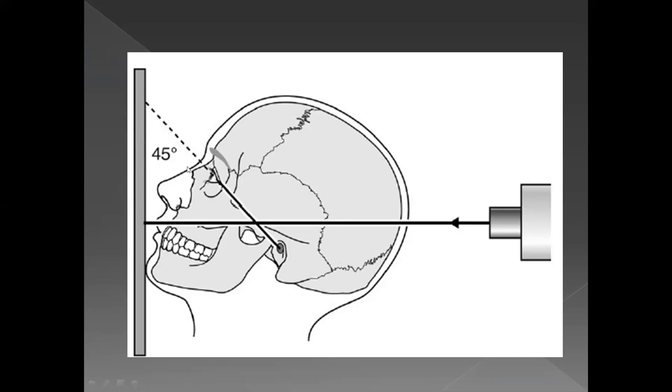And the standard line that we use is this canto-meatal line. In some places, you can also see it mentioned as OML, which is orbitomeatal line. So you can also call it that, the orbitomeatal line. So this orbitomeatal line has to make a 45-degree angle with the X-ray film. This is the X-ray film over here. And you fire the X-ray through the body of the zygoma, specifically maybe through its lower or inferior surface. So this is the standard way in which you take this radiograph.